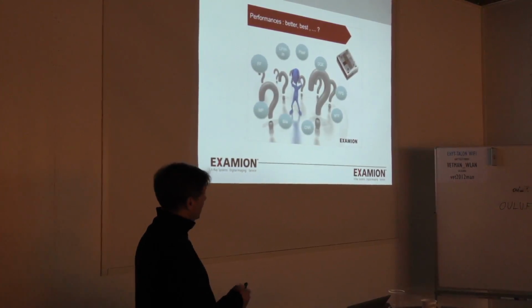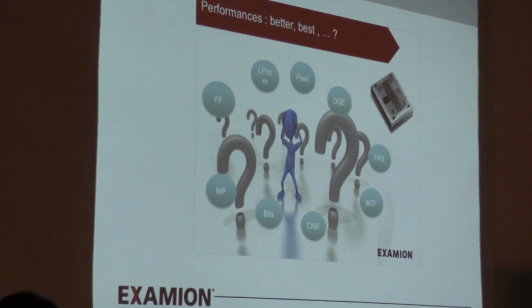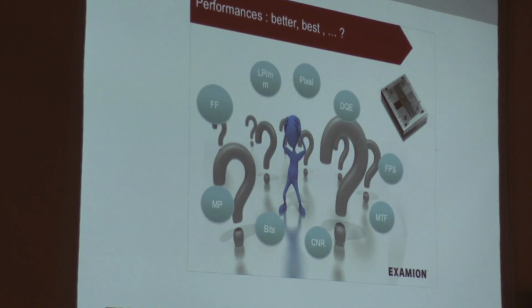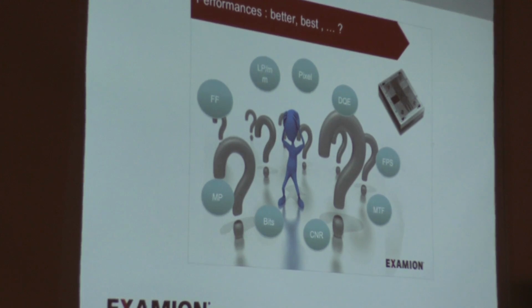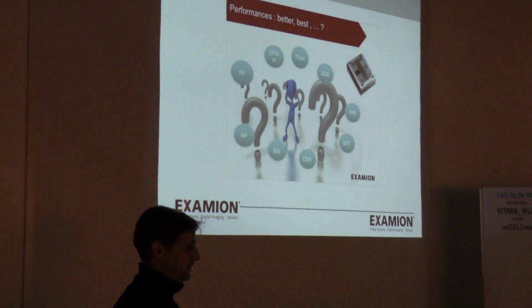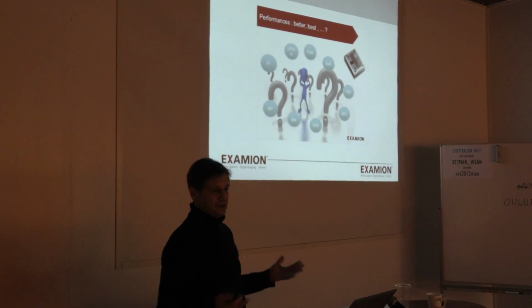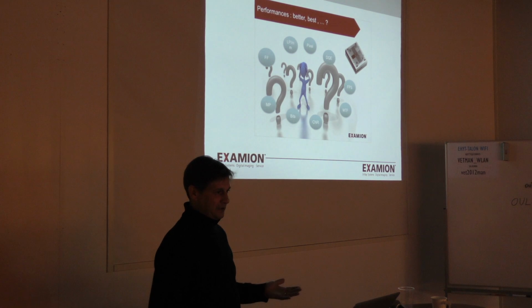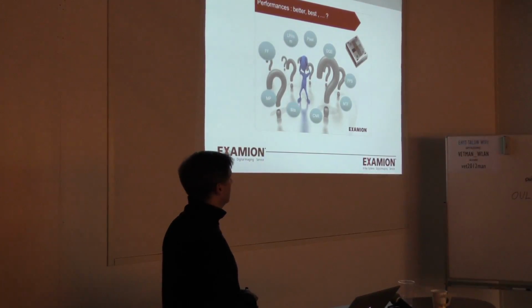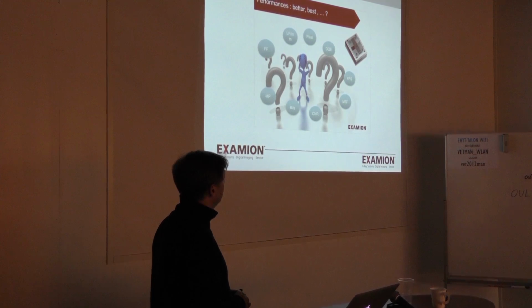Performance is, again, if you go to media and you try to evaluate panels or images or screens, even monitors, there are a lot of parameters involved. Again, I find that for a lot of clinics it's very confusing. In the beginning it's confusing for everybody because not all the data are readily available. They should be, but they are not. There's no law saying that you have to provide all the data. But I think it's very important to know.